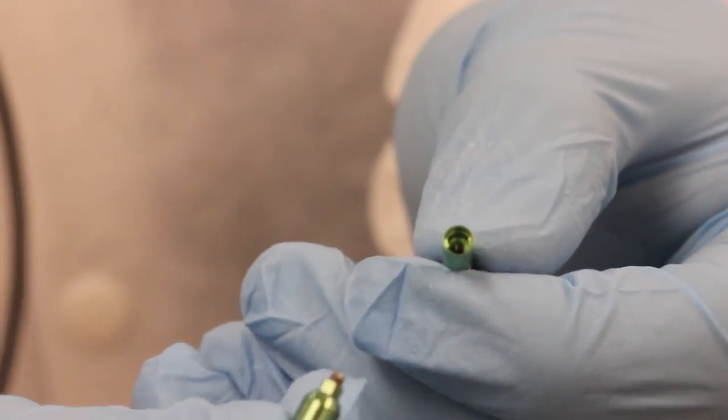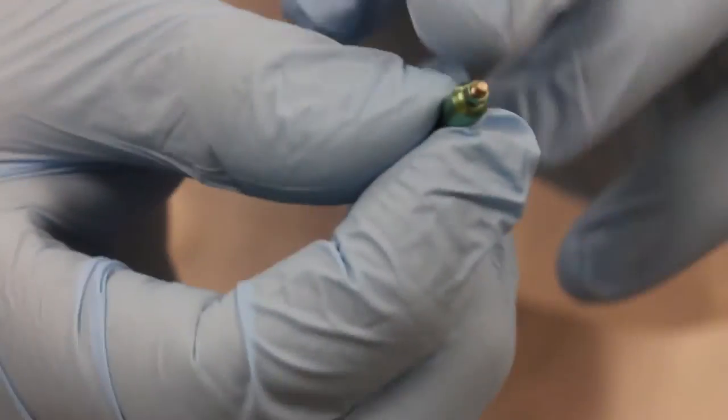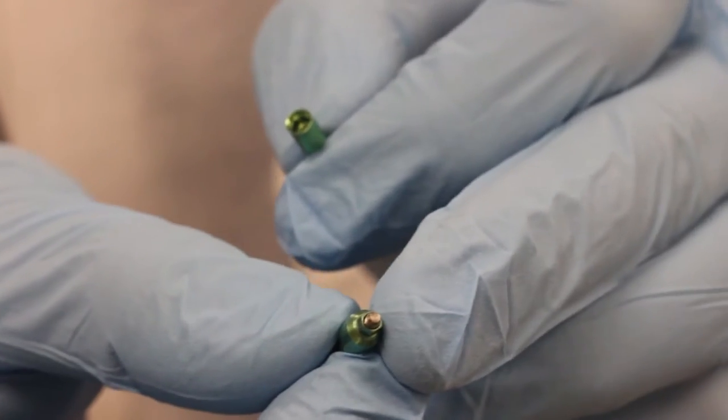In this video, I'm going to demonstrate how to restore an implant restoration from impression to crown fabrication.